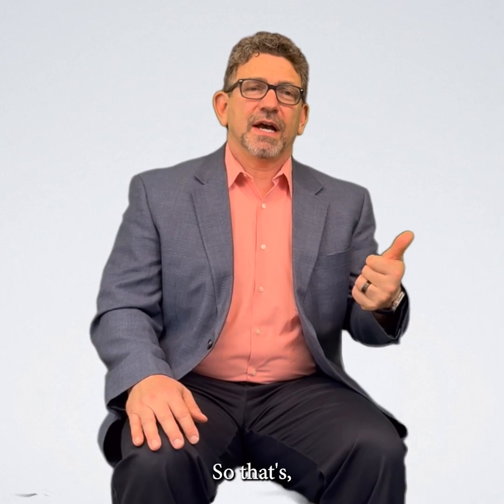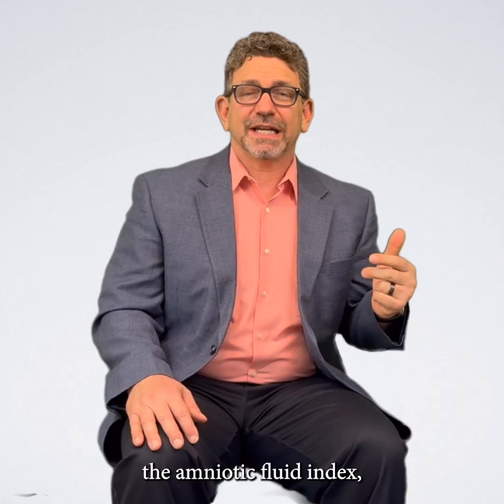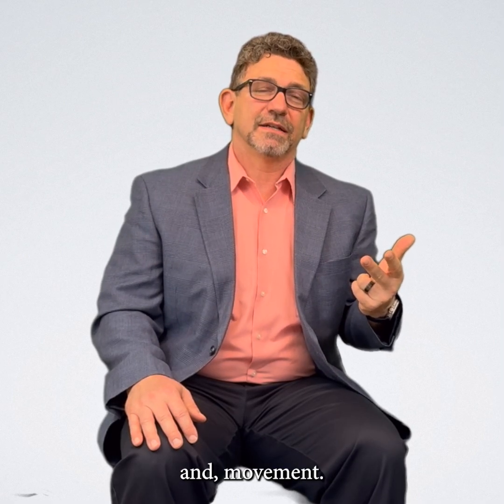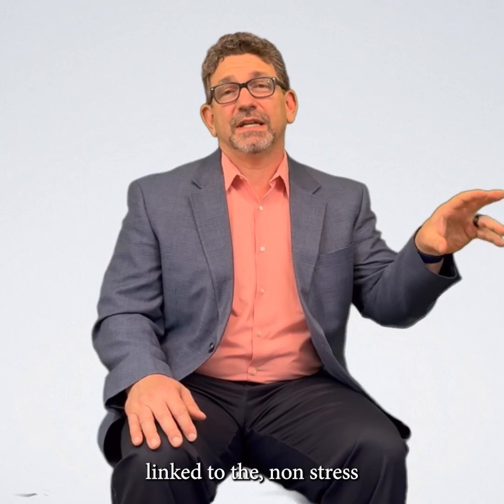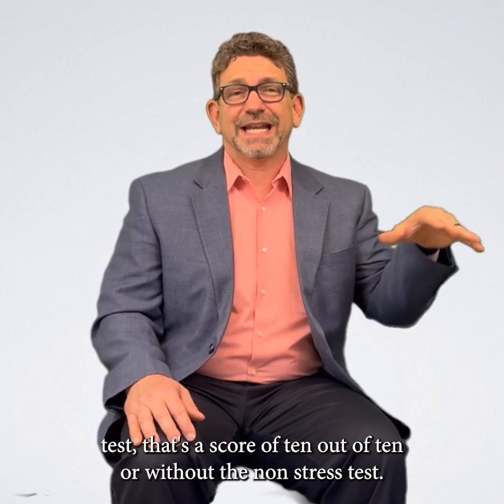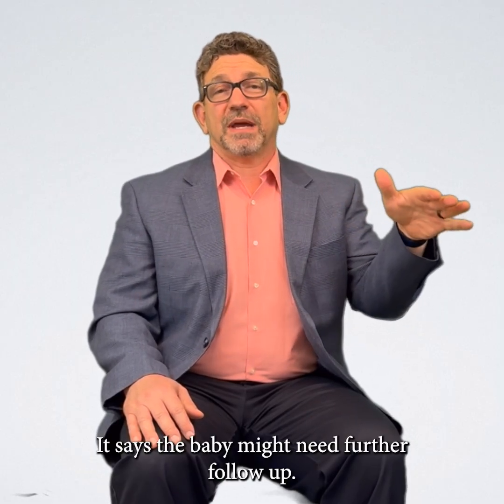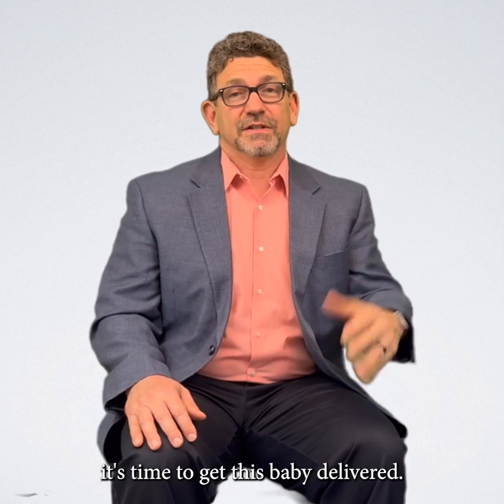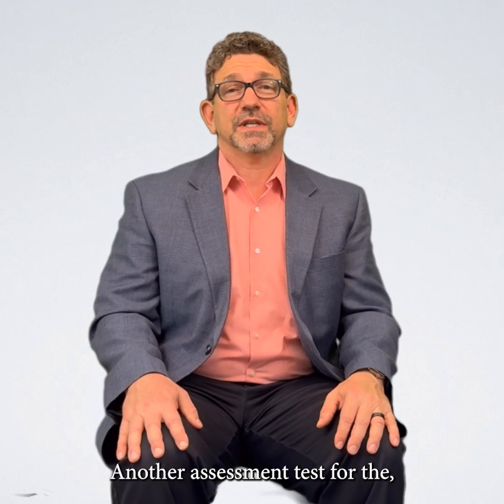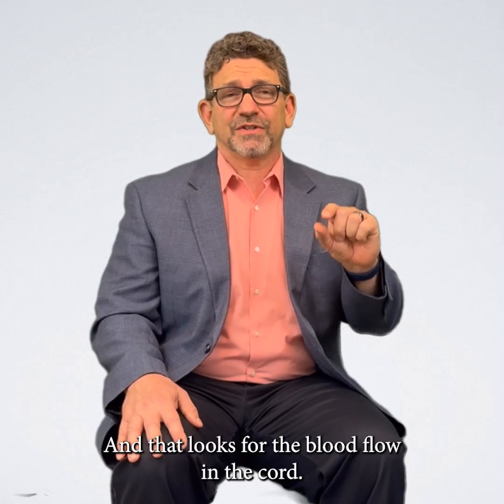And so that's breathing, tone, the amniotic fluid index, and movement, okay? And then linked to the non-stress test, that's a score of 10 out of 10, or without the non-stress test, 8 out of 8. If the score is lower, it says the baby might need further follow up. If it's low enough, it might be an indication that says, okay, it's time to get this baby delivered.